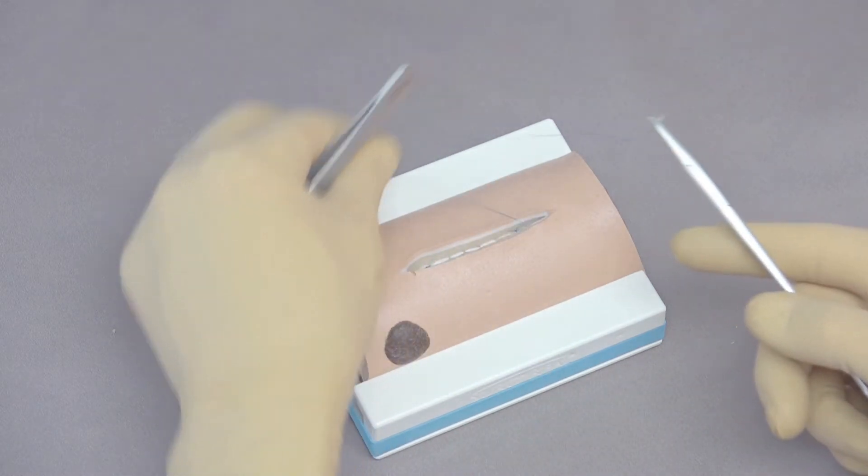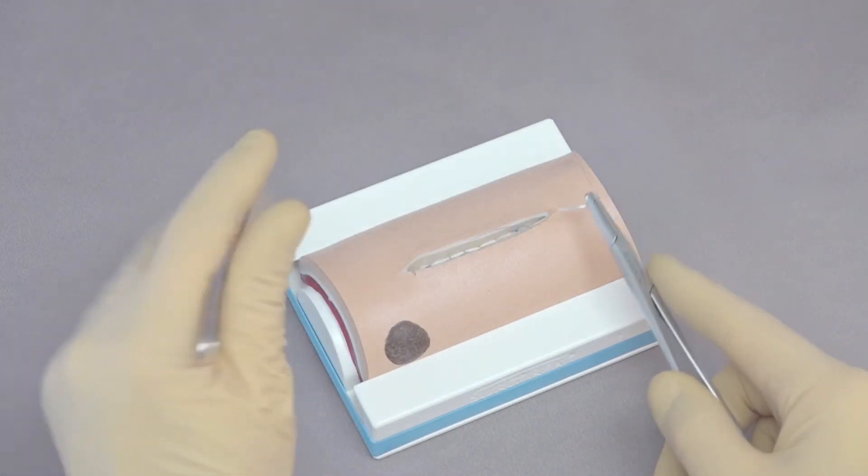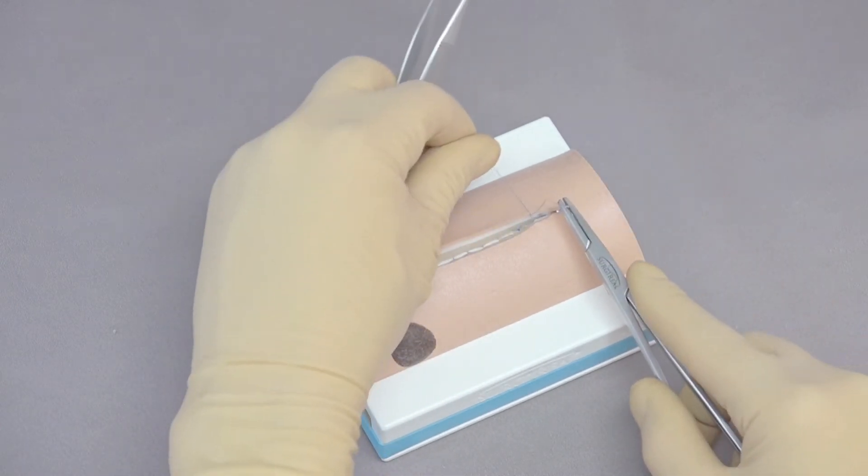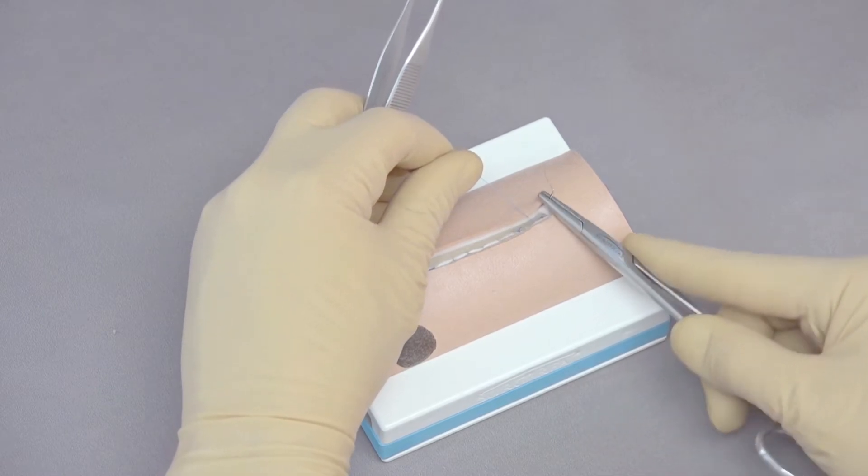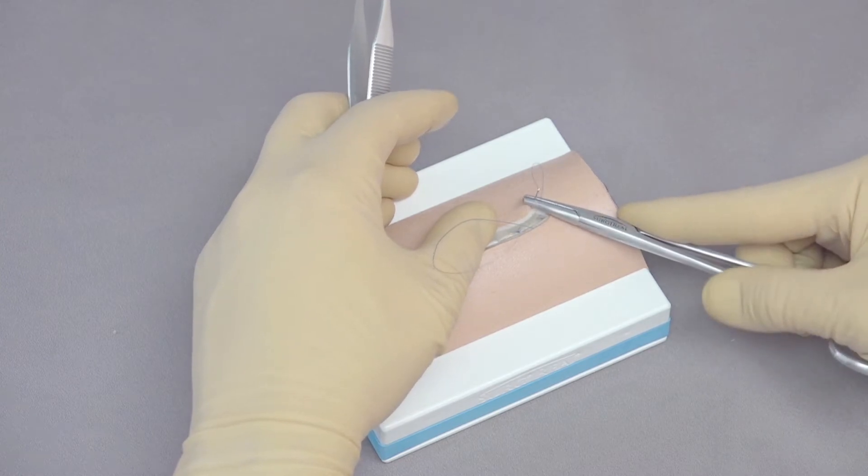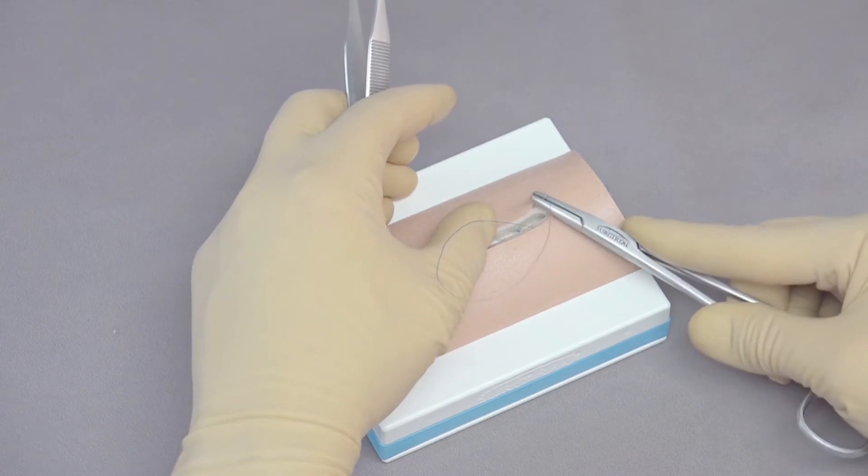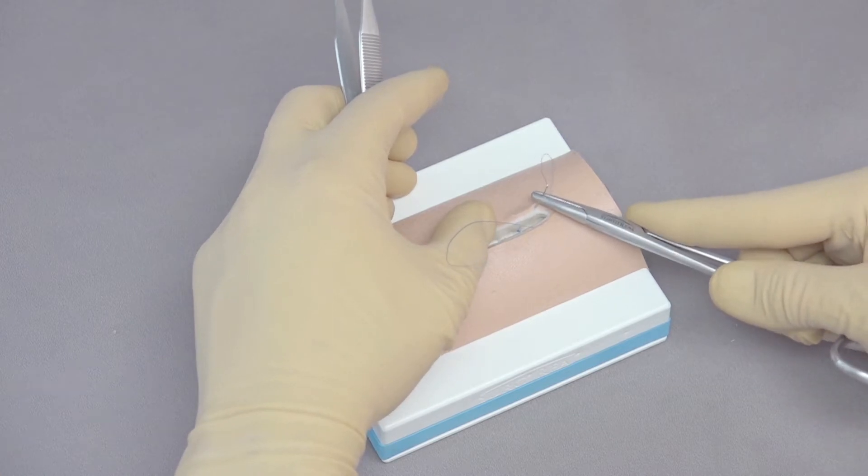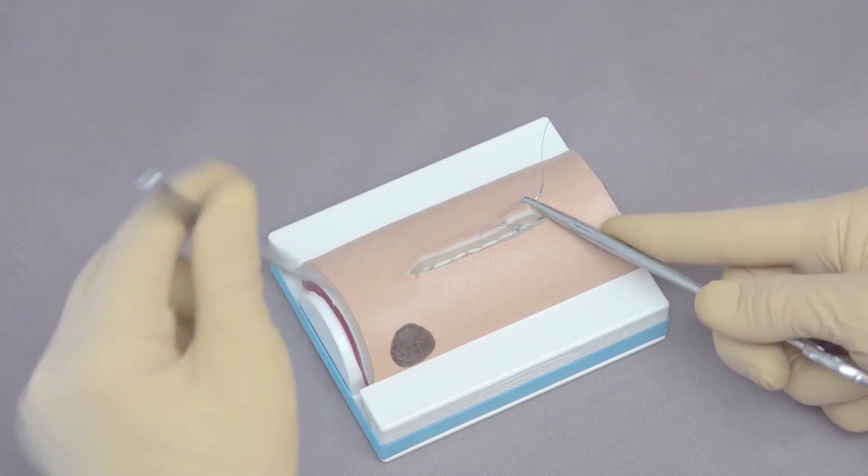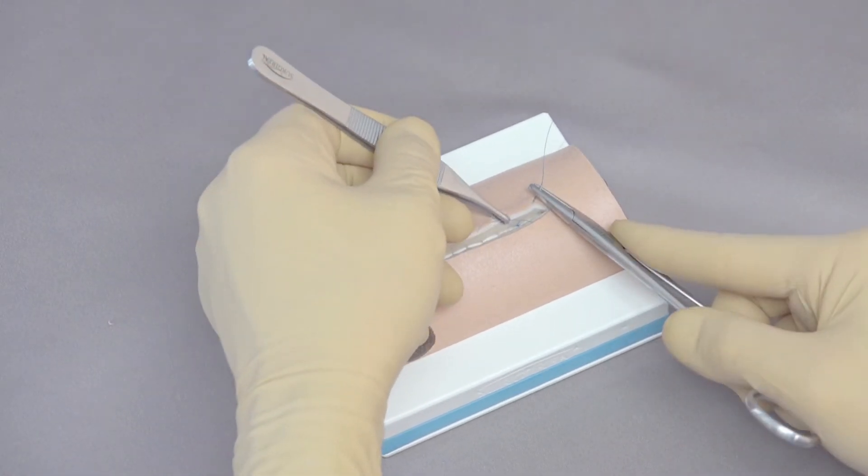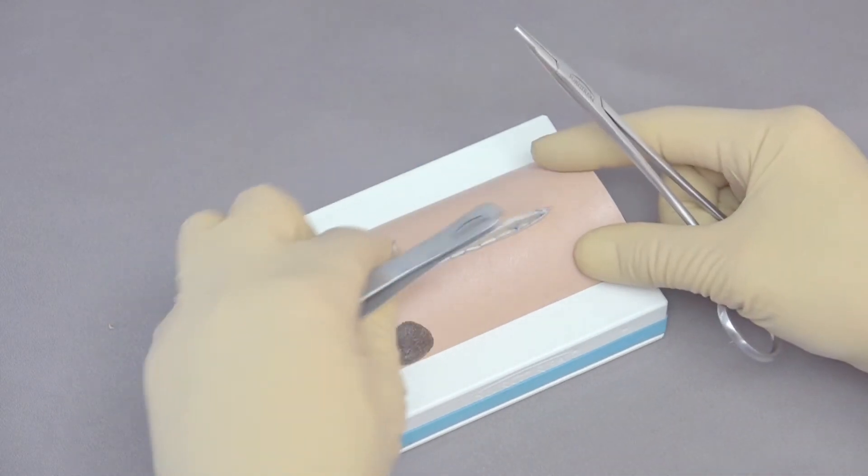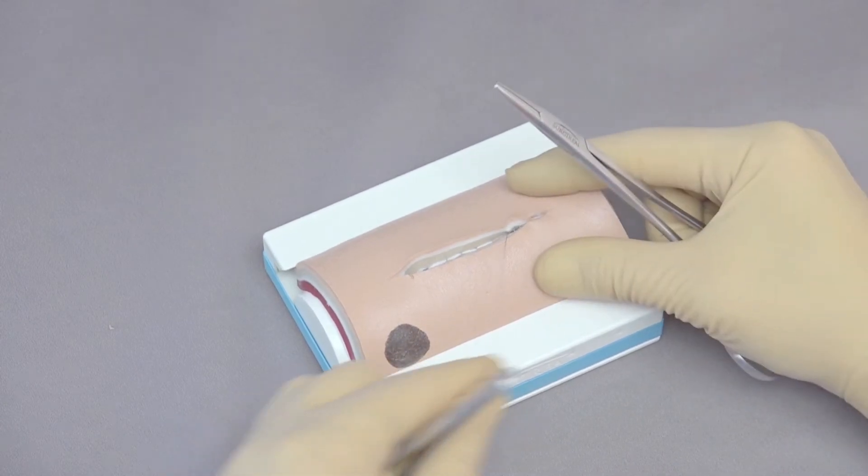If you come forward or backwards you will end up having uneven suture bites and that puckers the side. So if we pull this over and see right where it should be, we'll come in right at that same level. And we're going to make sure that our suture goes in at the junction of the dermis and epidermis. And then we want it to come out at the junction of the dermis and epidermis. So that takes a little time to do that. You can see that I'm working to make sure I get it just right where I want it. And once I have it where I want it, I'll feed that through, stabilize the needle. Now I can bring the needle through. And if I pull these together, you can see how that's opposing the skin.